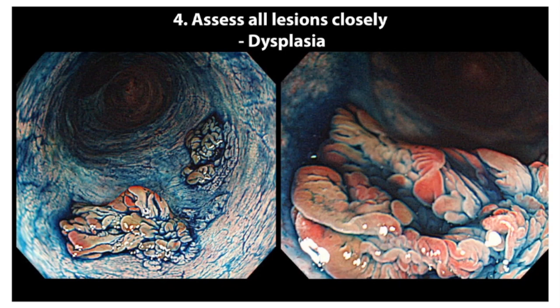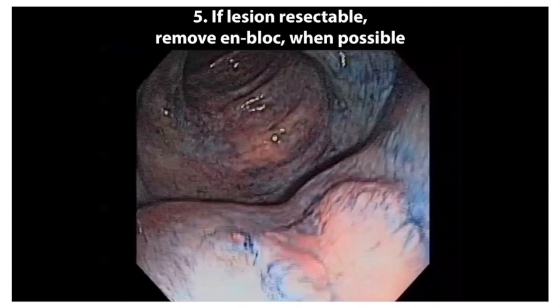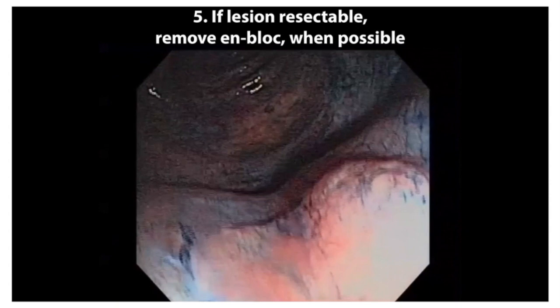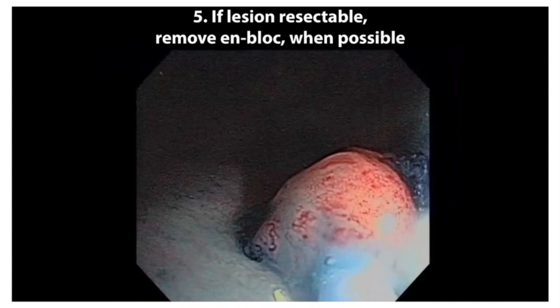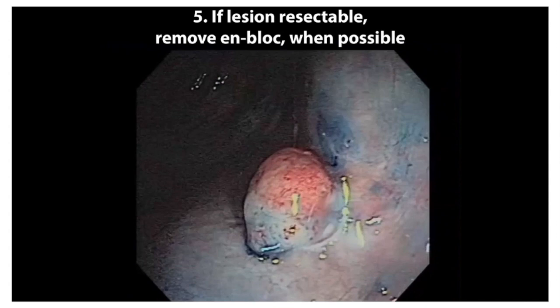In a patient with chronic colitis, two well-demarcated, slightly raised lesions were readily identified. On close-up view, the lesions resembled villous adenoma. They were resected with EMR and confirmed as high-grade dysplasia. Non-polypoid lesions within colitic areas may be removed endoscopically if they are well circumscribed and do not have features suggesting invasive cancer. Whenever possible, non-polypoid lesions less than 2 cm should be resected en bloc using EMR. Following resection, the surrounding mucosa should be biopsied to exclude unrecognized flat dysplasia, which would usually require surgical resection.